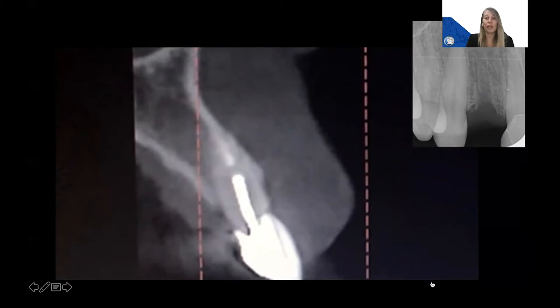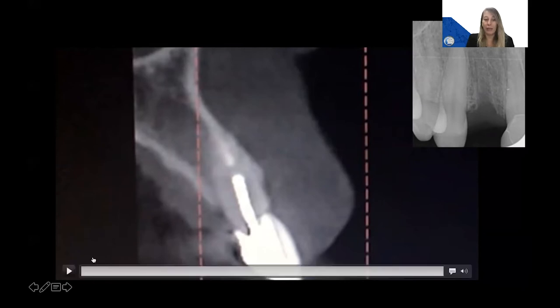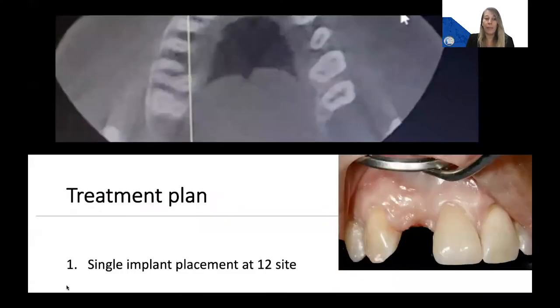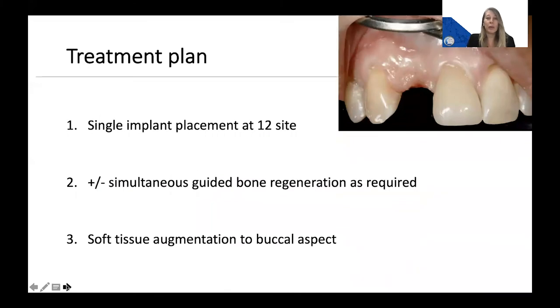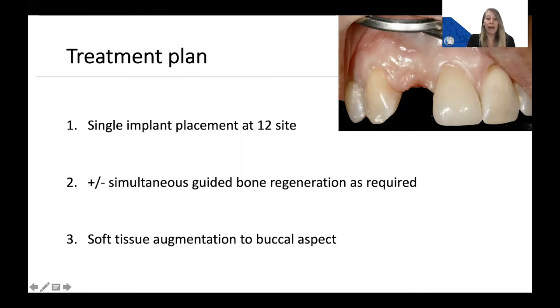A conventional PA was taken to ensure there was no residual pathology following eight weeks of healing. We discussed a number of treatment options for the patient, including alternatives such as a permanent removable prosthesis, a fixed dental prosthesis via a cantilever approach from the already restored central incisor, or a conventional three-unit bridge from the central incisor to the canine site. However, both myself and the patient found that a single implant at the 1-2 site would be the preferred treatment option to facilitate a screw-retained implant-supported crown.